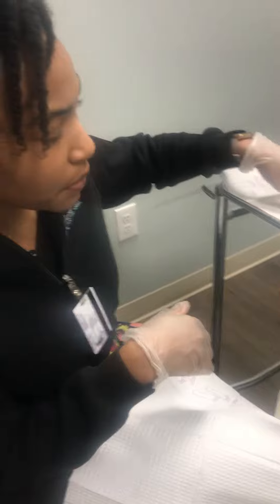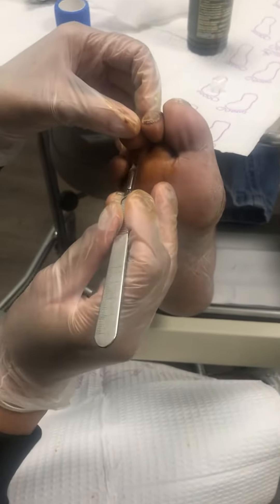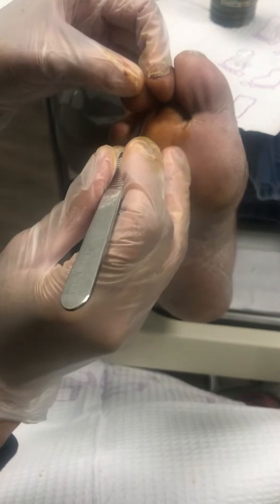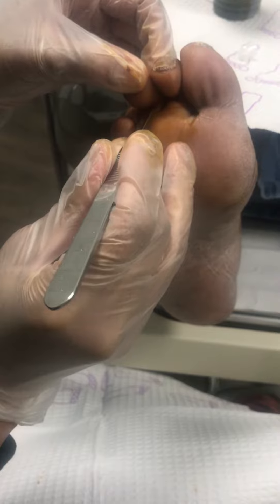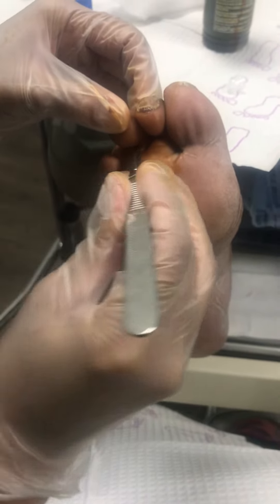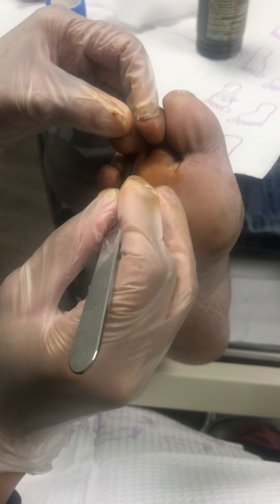So she's all numbed up and here we go. All right, we're going to go right here. You okay? Does that hurt? Do you feel that? I'm going to take the blade back.